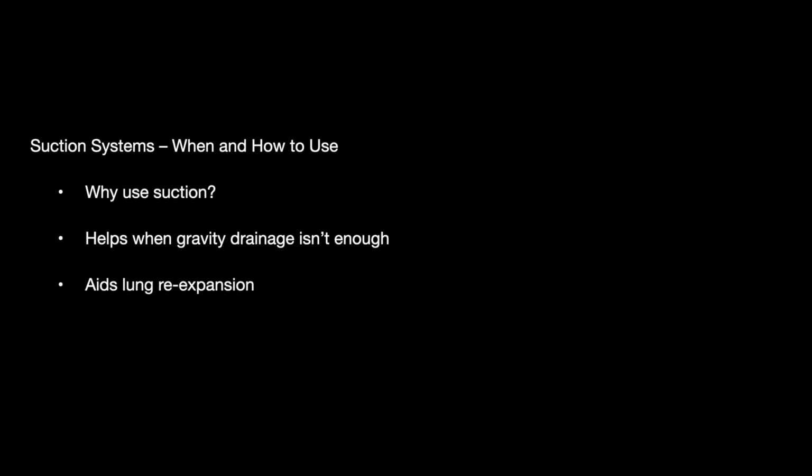Regarding the suction system, when and how to use it, why do we use it? First, because it helps when gravity drainage isn't enough and you think some extra pressure can help. It aids in re-expansion also. It stops the air leak in pneumothorax by pressing the pleurals together.